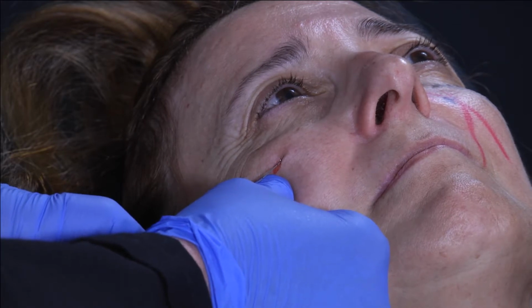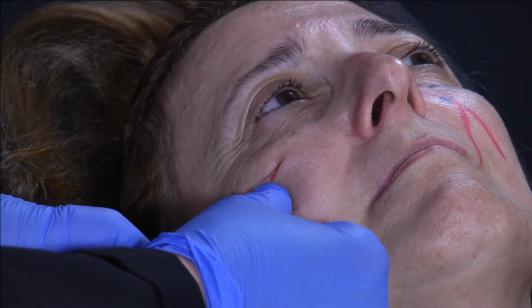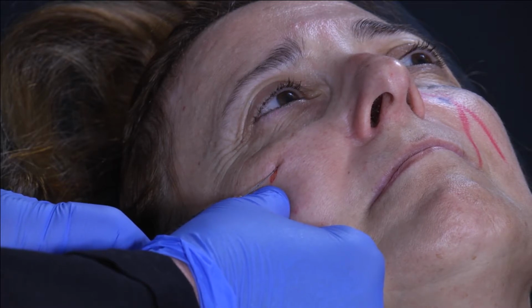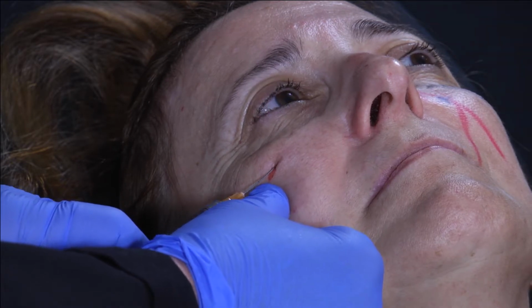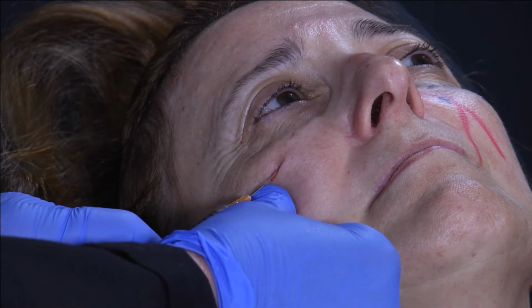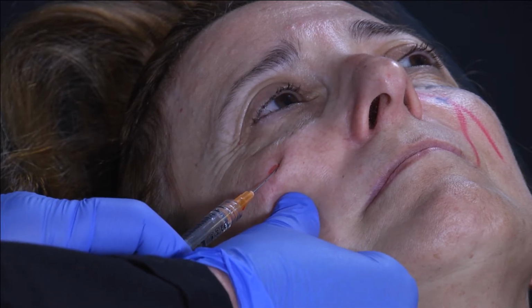This is the secret: small amount of product. I don't know if you see my cannula, but I'm in the tear trough, and slowly I inject in the tear trough. I put less than 0.5 for this patient. Do you see where is the tip of my cannula? You see how it moves up? And now I'm very high. I'm at the top of my tear trough.